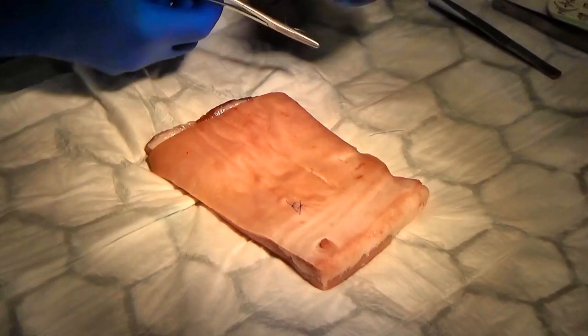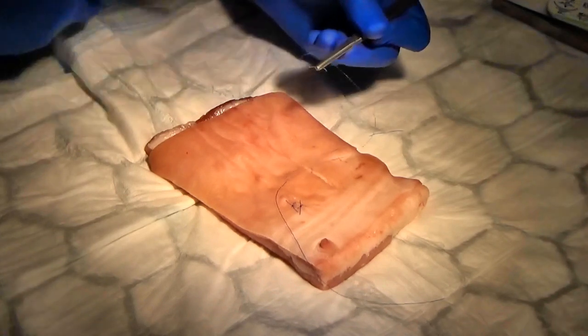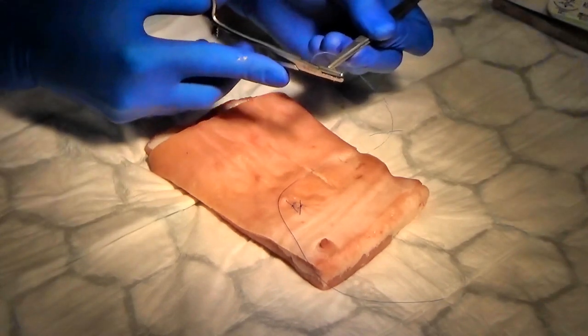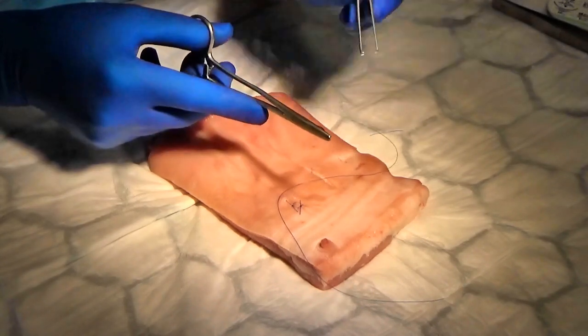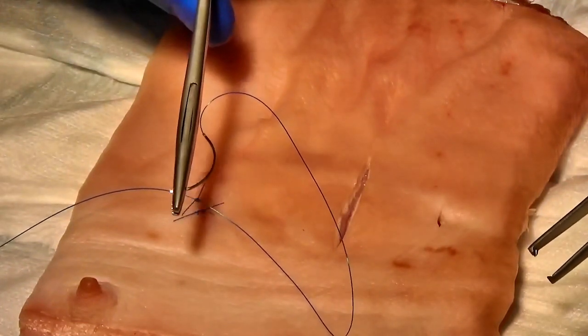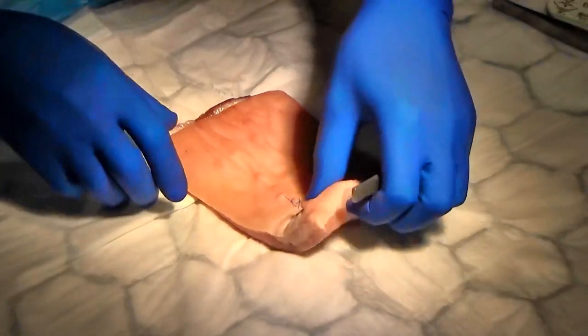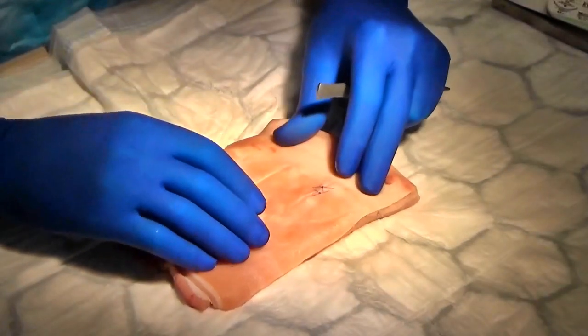Now a little bit about needle safety. If you're going to put the needle down to come back to use it again, do it like that so that the point is not going to injure anybody. Now, just to make things a little bit clearer, what I'm going to do is alter the angle.